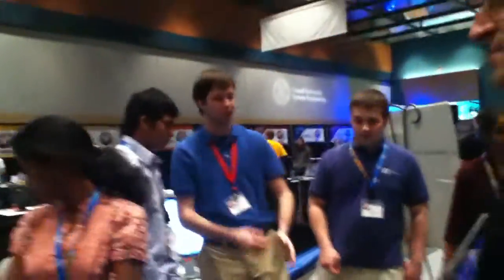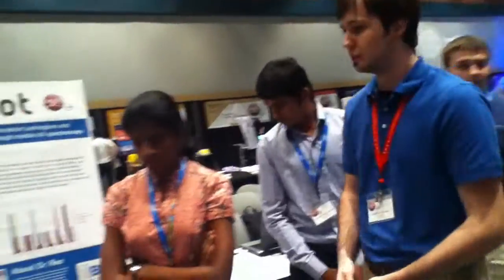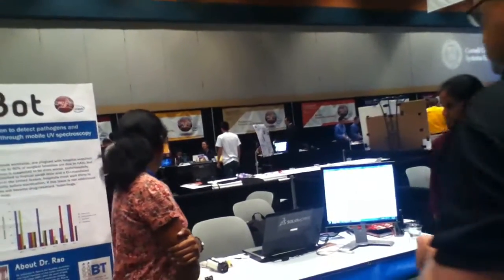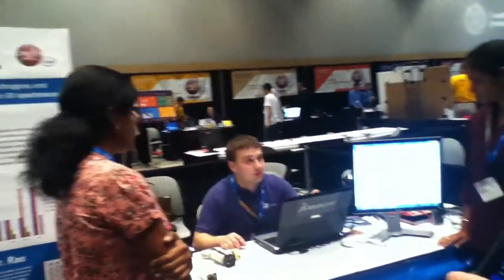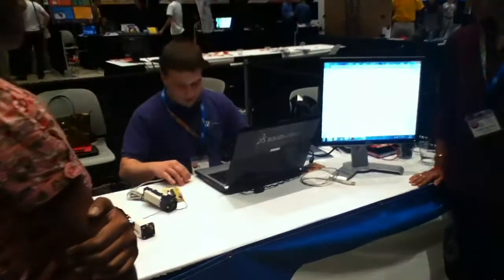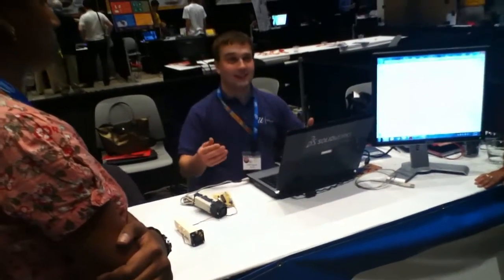We're going to demo the sensor first and then get the robots fired up. Our sensor is right up front here. We're showing the two separately — as we said, the sensor is modular and able to hook up to any computer. Supposing it doesn't get the demo jitters.